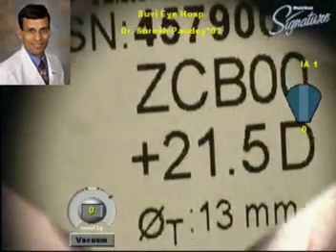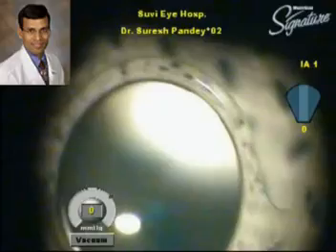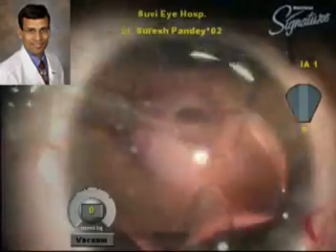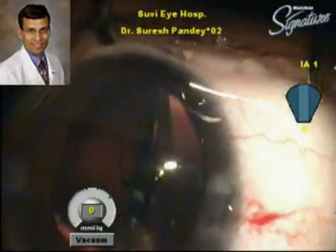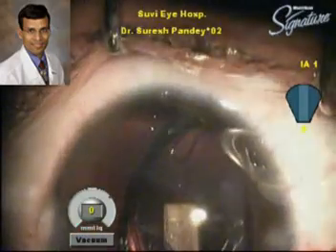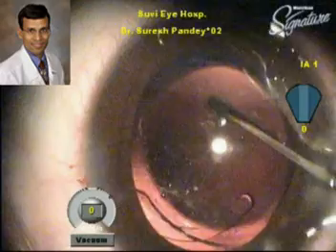In children, a single-piece hydrophobic acrylic IOL is preferred because of the greater biocompatibility of the material, as well as the single-piece configuration that allows implantation into the small capsular bag of these children. And the hydrophobic acrylic IOL also has the least degree of posterior capsular opacification in the postoperative period.